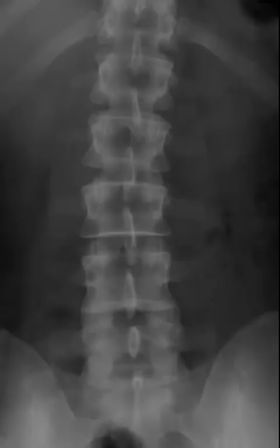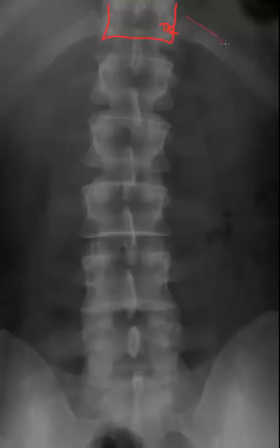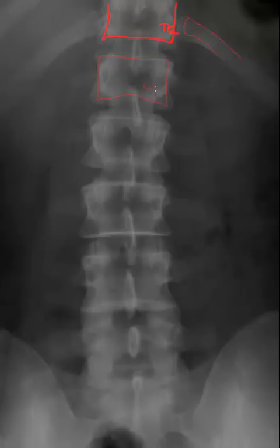Let's begin with some basic radiographic anatomy. The thoracolumbar region is very important because, as with any transitional area of the spine, anomalies can occur. This is T12, and you can see the T12 ribs here. The most important thing is to count how many non-rib-bearing segments you have. In this case we are demonstrating five non-rib-bearing segments, suggesting no transitional area anomalies. There are no ribs coming off the L1 segment, which matters because counting levels can be thrown off if you mistake L1 for T12. Be sure to count your lumbar segments before writing a report.